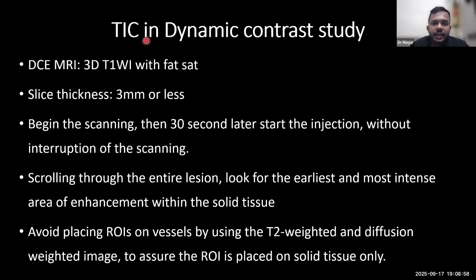Time intensity curves and dynamic contrast imaging. Whenever we are performing the dynamic contrast scan, we have to start the injection of contrast medium after 30 seconds of the scanning and without interruption of the scan.